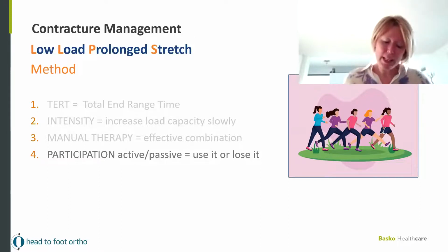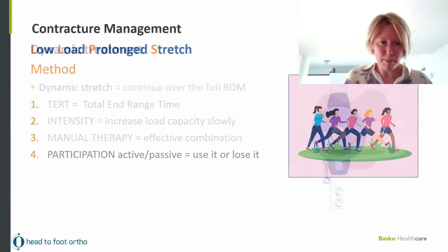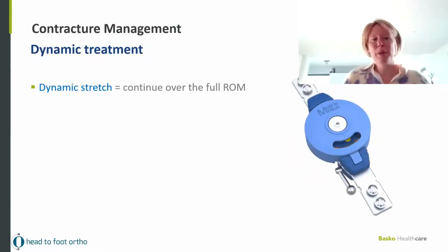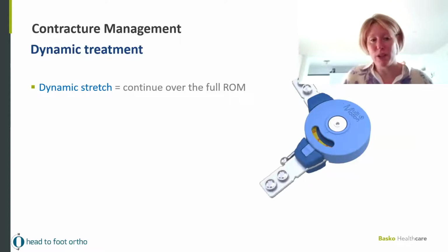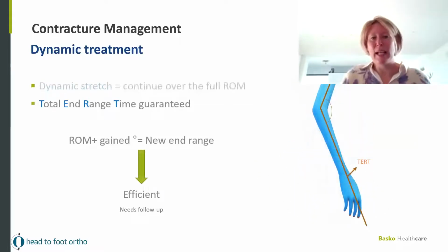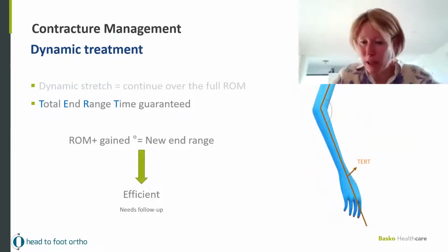We already said it. If you have gained in range of motion, it's very important that you just try to use it, and it's really that if you don't use it, you will lose it. So we call it the dynamic treatment because we will apply the dynamic stretch over the whole range of motion. And we talked about the total end range time.